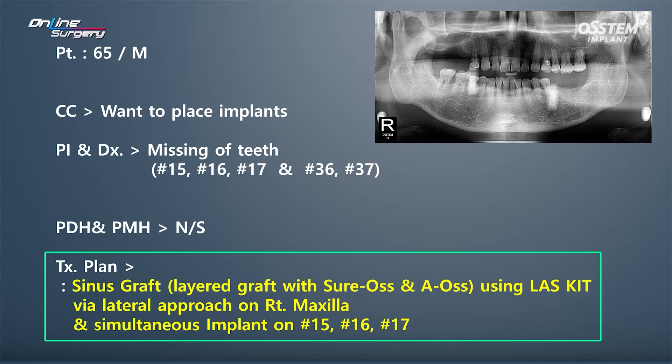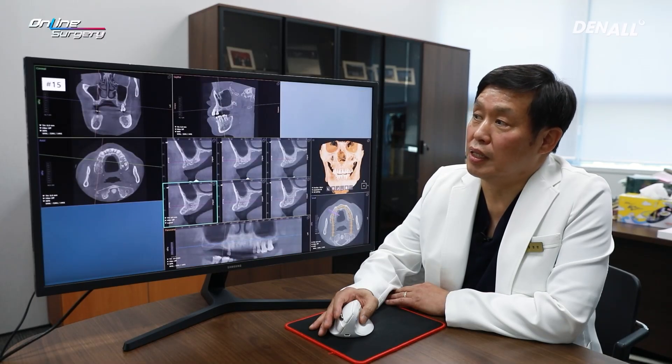As for the bone graft, I decided to use a layered bone graft approach. I would use Sureos, the allogenic bone, on the bottom, and use Leos, the bovine bone xenograft, on top. At the same time, I decided to place three implants at once.